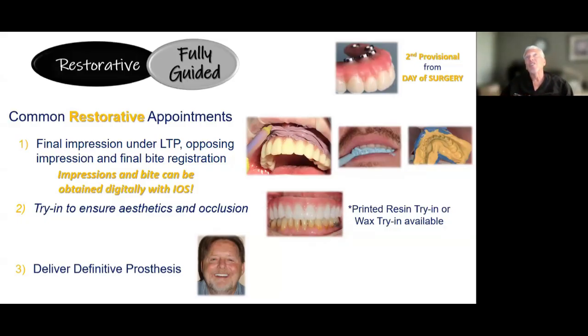If you think about implant, crown, and bridge, the emergence profile of a crown, you have a deep sulcus that the lab would really love to get those impressions. We love those contoured healing abutments or your temporaries that have been contoured like a tooth, what have you, because we capture that emergence. We can see that emergence, and we can develop that crown to just nicely flow and blend into that. We can do the same thing with this full arch.